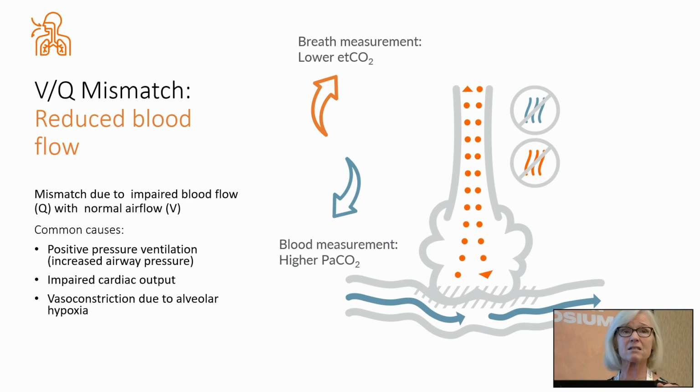So in all cases of ventilation perfusion mismatch, whether they're from airflow or from blood flow issues, or very, very likely both, your end-tidal CO2 measurement is going to be underestimated. It's going to be an underestimation of your PaCO2.